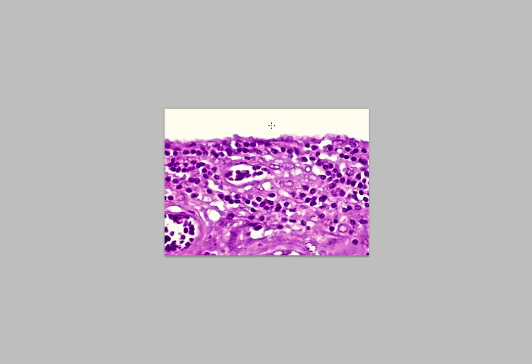Here's another picture of acute inflammation, and you can see a really good one with the segmenting, and you could go on and find a whole bunch of them. And here's chronic inflammation, and we can see all these inflammatory cells, and all of them have really smooth edges and round, oval, circular nuclei.